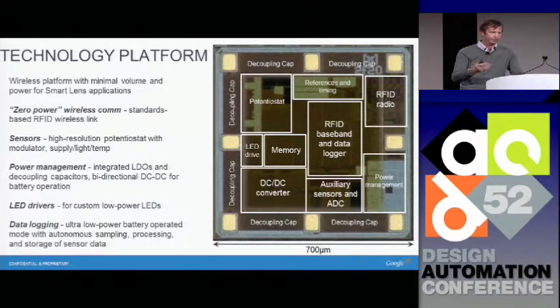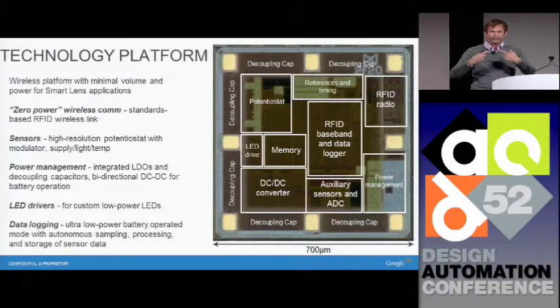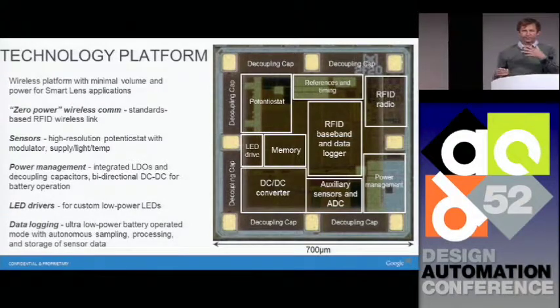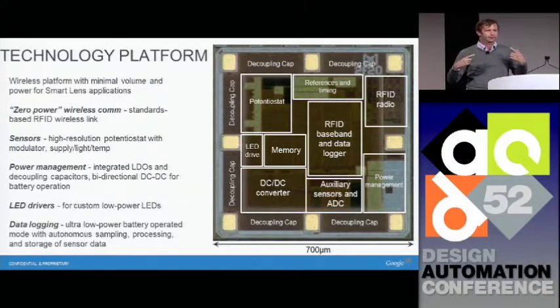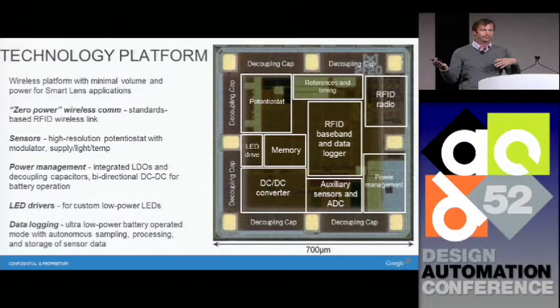You can communicate with it whenever you want. There's a carrier sense circuit that will detect when you're trying to talk to it. It'll fire up the baseband and you'll be able to communicate with it. RFID and NFC radios, they don't generate and transmit any RF energy. They rely on backscatter. So the integrated circuit in the contact lens does not have to generate a precision RF frequency. And that's important for two very different reasons. One is it saves power. We don't need to generate our 13 megahertz or 900 megahertz carrier and actively transmit power off the eyeball.